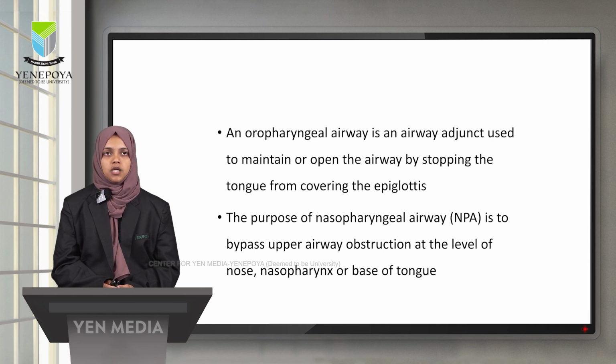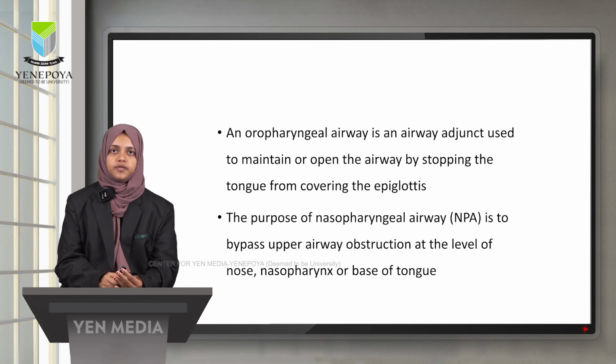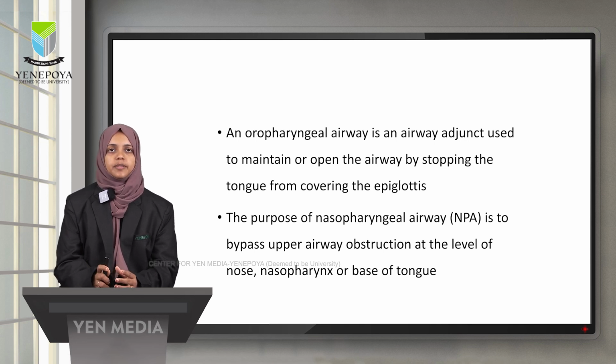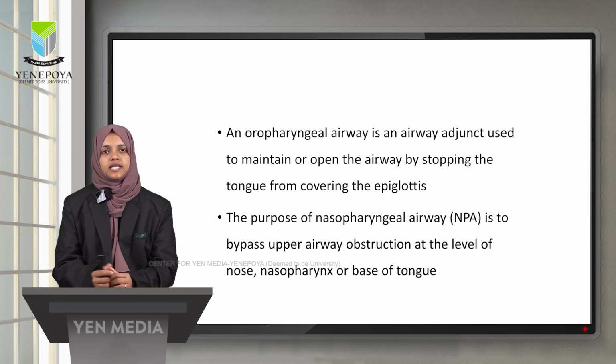So before insertion, you have to always take precautions such as using the proper size of the airway, properly lubricating the airway, and making sure the patient's laryngeal and pharyngeal reflexes are depressed. Before using an oral airway, make sure the patient is unconscious, and for a nasal airway, it is okay if the patient is conscious or semi-conscious.